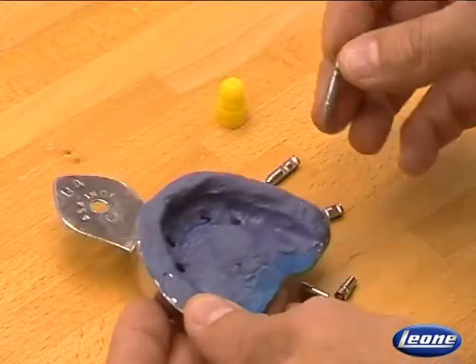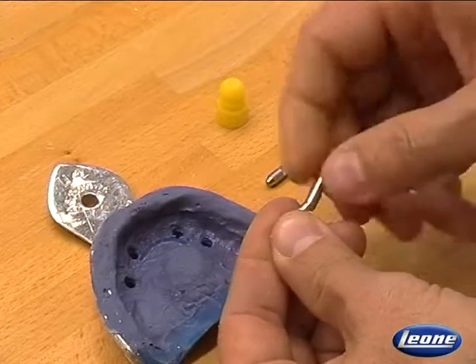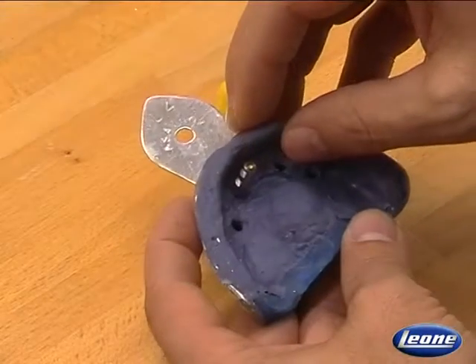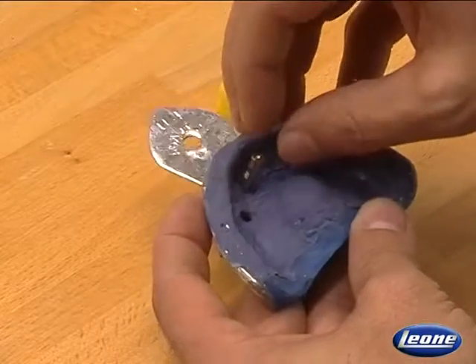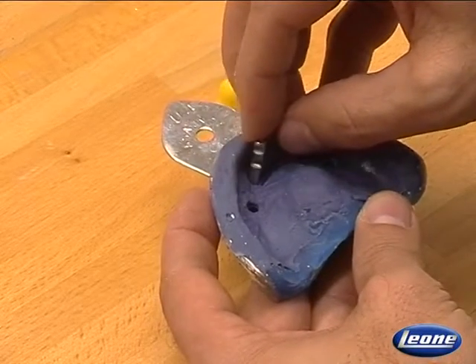We screw an angled abutment analog onto the transfer and try it in the impression. If we have to change the position, we can rotate the assembly, analog plus transfer, inside the impression. Please rotate only clockwise to prevent parts from being unscrewed.